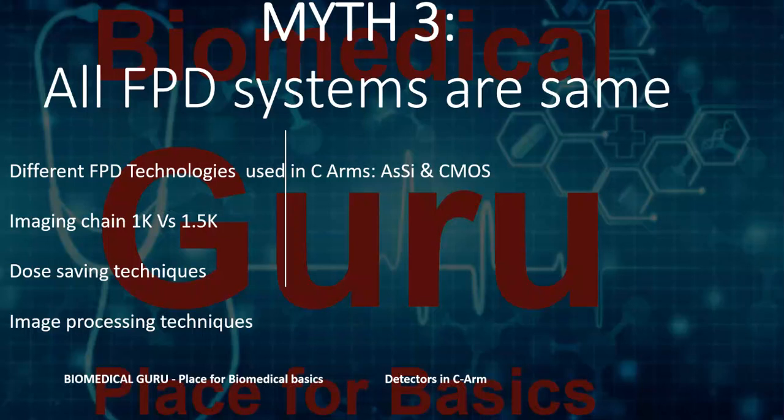Along with the imaging chain that I just mentioned, there is also what is called the image processing chain. For example, images may be captured at high resolution, but at what resolution the images are processed and displayed also matters. So imaging chain means the processing resolution, the capturing resolution, as well as the display resolution. If everything is 1K by 1K, then it's a 1K machine. If two of them are 1.5K and one is 1K, even then the machine is 1K. If all three are 1.5K, only then we can consider it as a 1.5K resolution system.